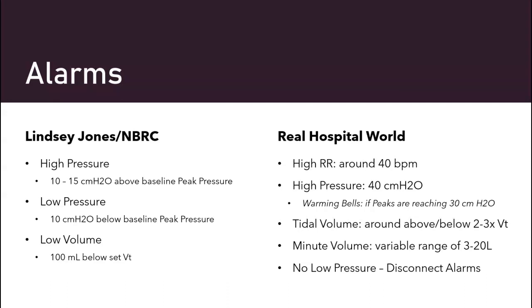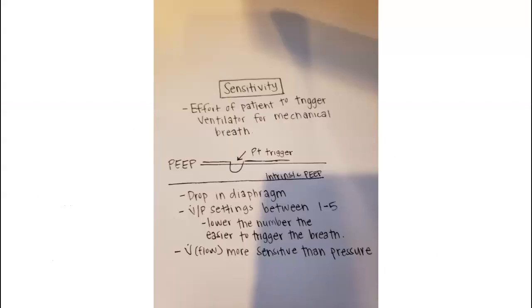Another thing we'll do, in clinical practice, is while we're setting up for an event, if we get a call that we're getting a patient from an outside hospital, they probably won't be here for a couple hours, but I'll just set up the ventilator a few hours away. That way I can just have it ready to go. I'll put my alarms in ahead of time. That way I don't have to deal with it. So there's that.